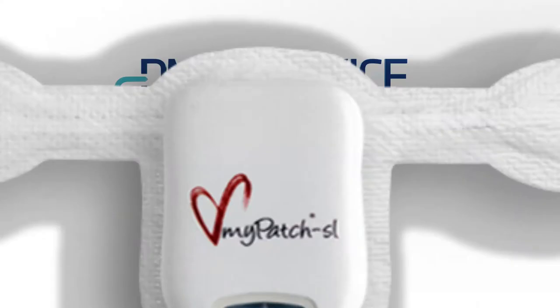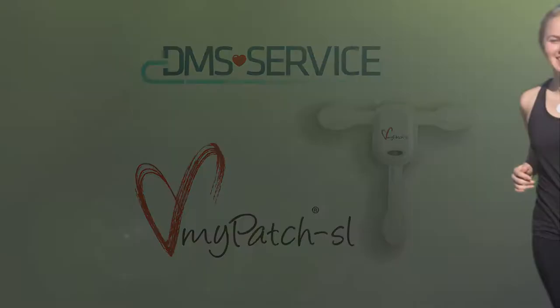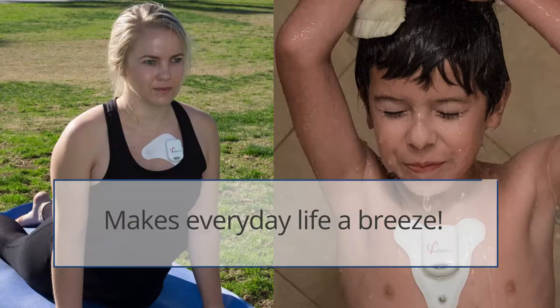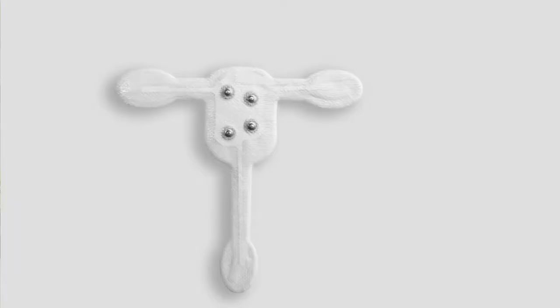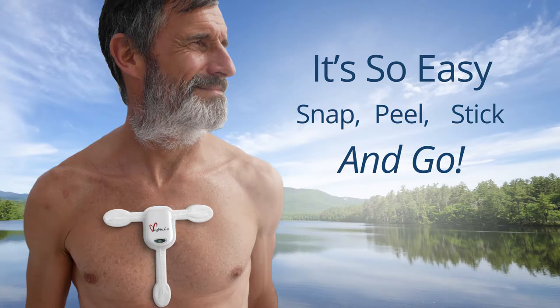DMS service has yet again revolutionized the industry with the MyPatch SL Holter Recorder. Finally, monitor your patients while they live life to the fullest. The lightweight, waterproof MyPatch SL makes everyday life a breeze. It's so easy — just snap, peel, stick and go. Patients can resume everyday activities immediately after application.